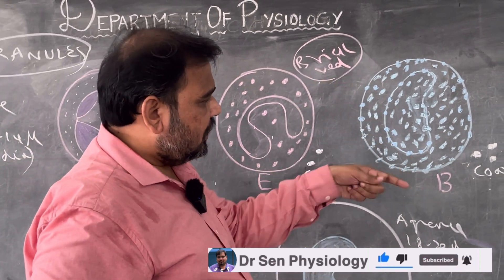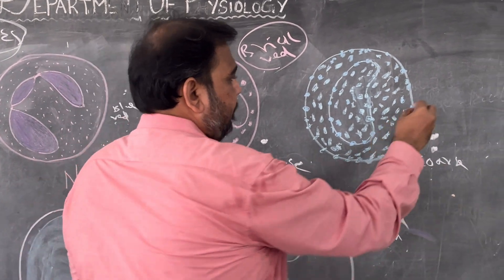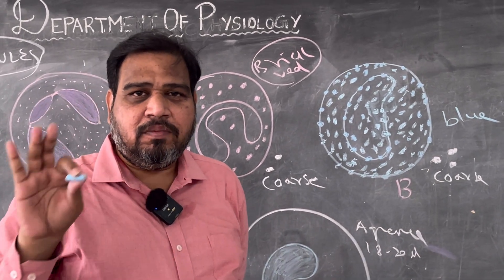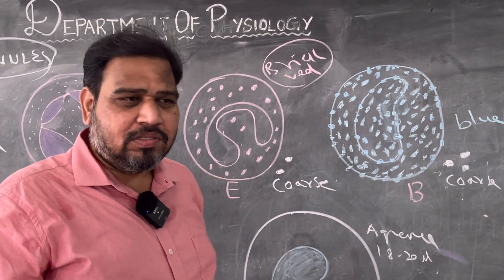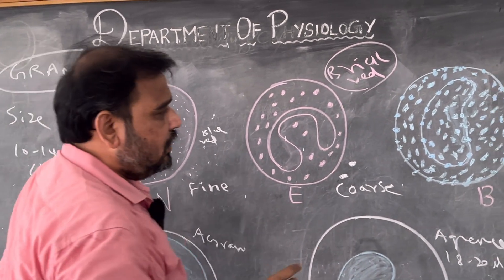Now coming to basophil. As you see the granules are coarse, color simple: blue color. So basophil usually when you see in the microscope under 100x it will be coarse, blue color granules. Same size, all the three are 10 to 14 microns in diameter.